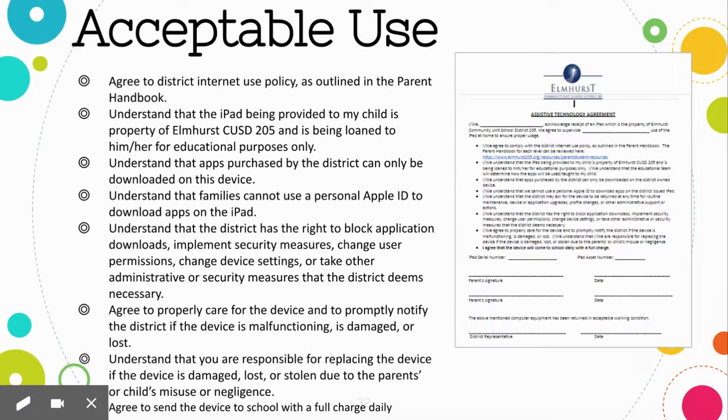This is specifically for students who are issued an additional device or equipment as part of their IEP. What you're agreeing to signing this is that you agree to the district's internet policy. You understand that the iPad is being provided for educational use only, and in this case, use as a communication device only. Again, we specifically ask that you do not use this iPad to watch YouTube videos or play any games. You understand that only apps purchased by the district may be downloaded onto the device.